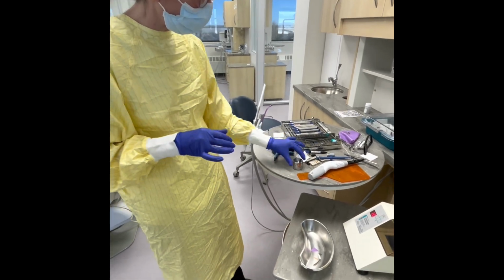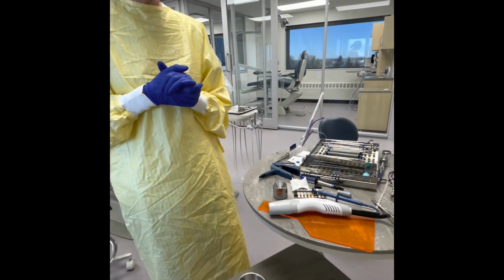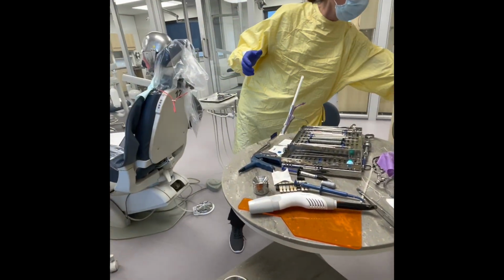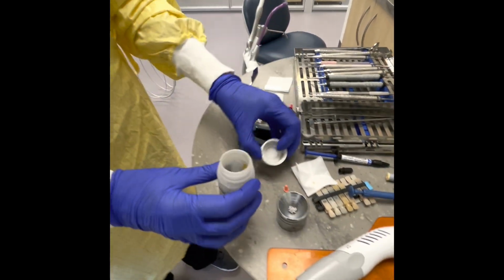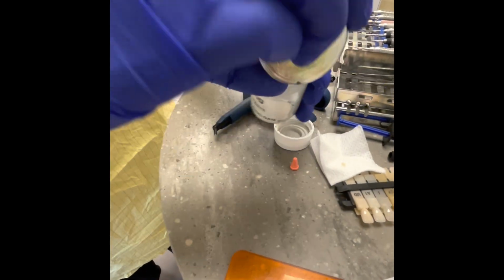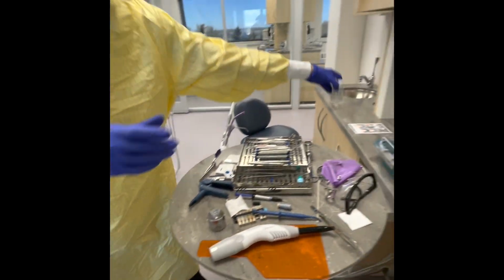So what I'm gonna do first is get rid of my amalgam pieces. I still have some left over. I can't throw those in the garbage. So we have a scrap amalgam container that those will go in until they're discarded properly. So I literally just dump that in like so. Put the cap back on and get that out of my way.